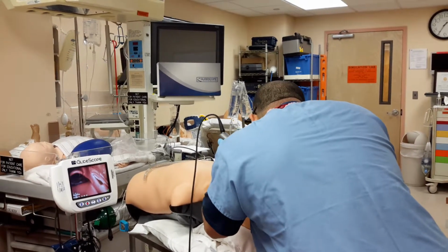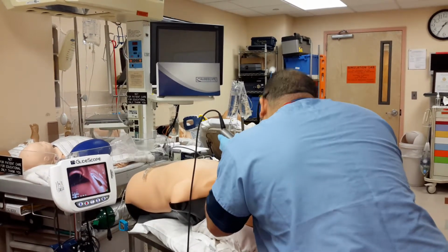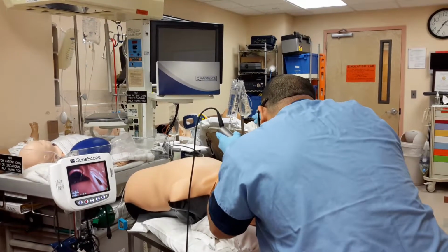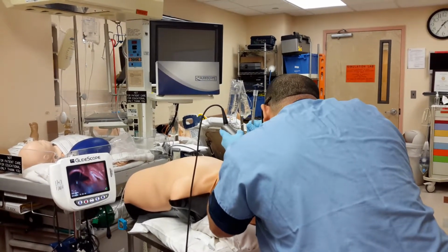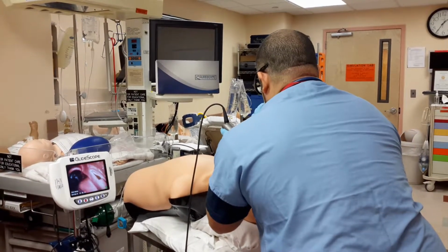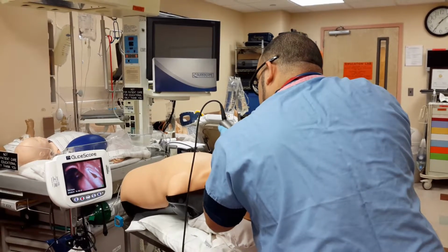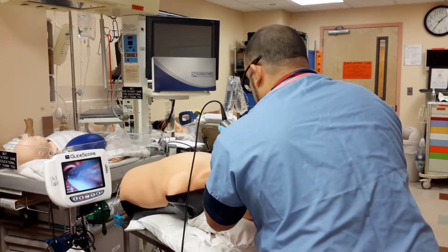I see the glottis. I can do epiglottoscopy. Talk to me, Dr. Levitan. I see the cords. Okay. I have a Mac view. I'm ready to intubate. Now, where they say go midline, I'm still trying to use this like a Mac blade. Kind of feed it through the cords first. The stylet is unique. Pull back on this stylet so it allows me to advance. Pull back a little more. Advance the tube the depth I want.